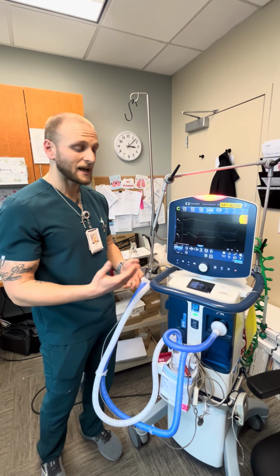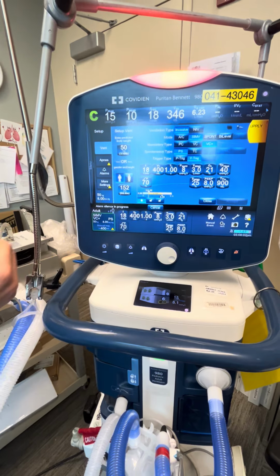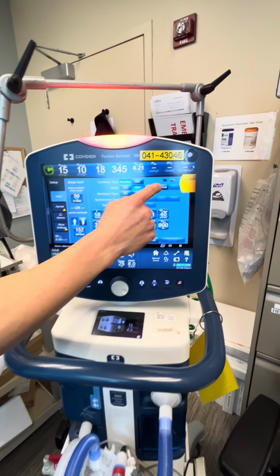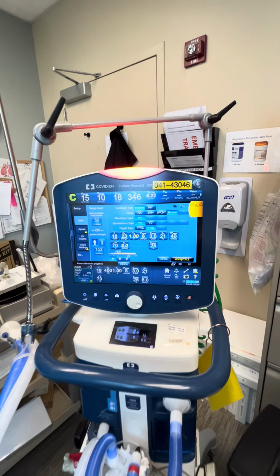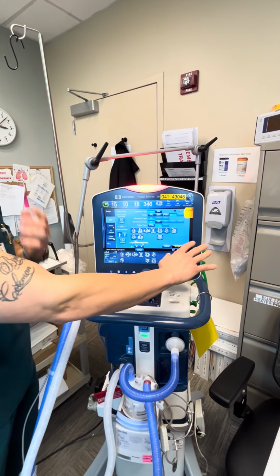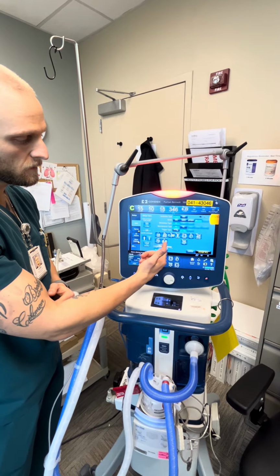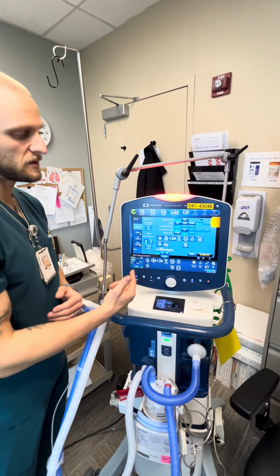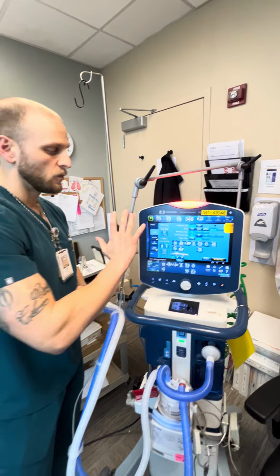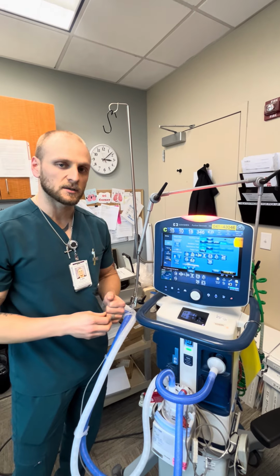So first things first, how do we get to bilevel? We're going to come right here, just like we would switch to any other mode, okay? And you see right here, it says bilevel. You push that. Once you push that, it'll transfer everything over, okay? So just going through the initial settings, we have our frequency, our P high, P low, our T high, pressure support, oxygenation. Everything else, we're not going to fool with. The only things that I just went over are the ones we're going to manipulate per our patient, okay?